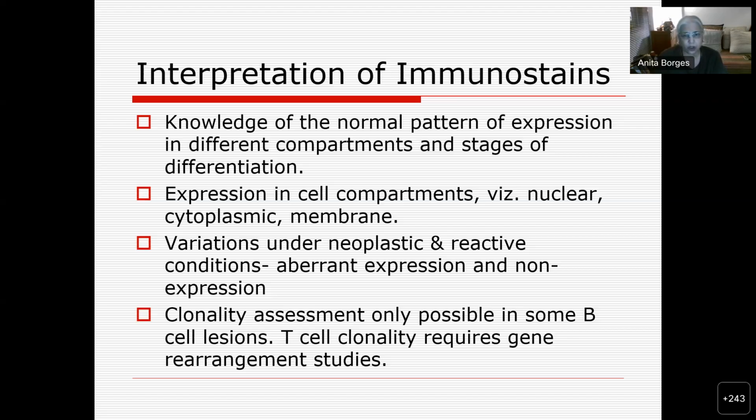Okay, so there's a lot of it. When you have immunoglobulin which is being expressed on a surface, that becomes a little more difficult to do on immunohistochemistry, unless your immunohistochemistry is really A class. It's not always easy to do that, but routinely we just look for intracytoplasmic light chain restriction.